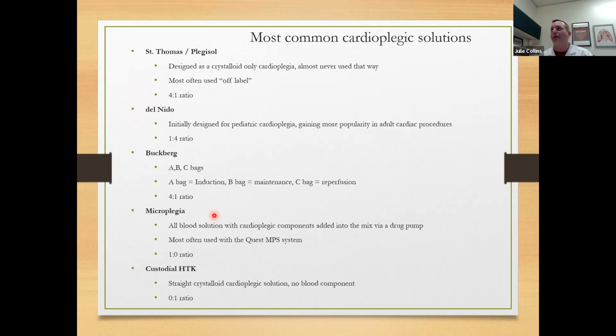What I actually think is there's a big disadvantage to it. What do you think that might be? Well, given the fact that we're not actually diluting the blood, we could have a high viscosity, and that can actually lead to less perfusion? Great answer. So typically, are we giving cardioplegia cold? Would you say that's typically how we give it? And we're giving it very cold? Does cooling it down make it more viscous or less viscous?